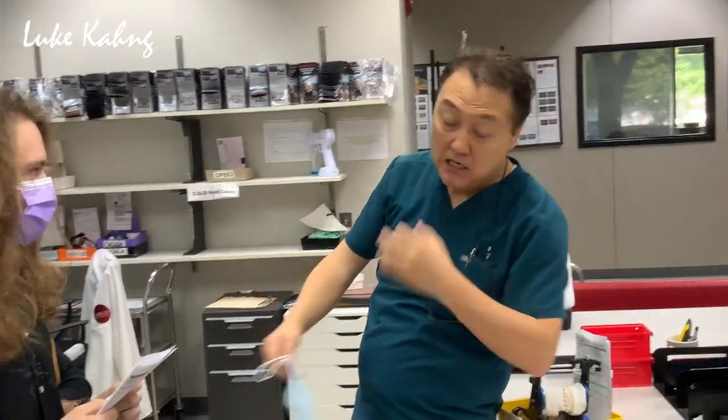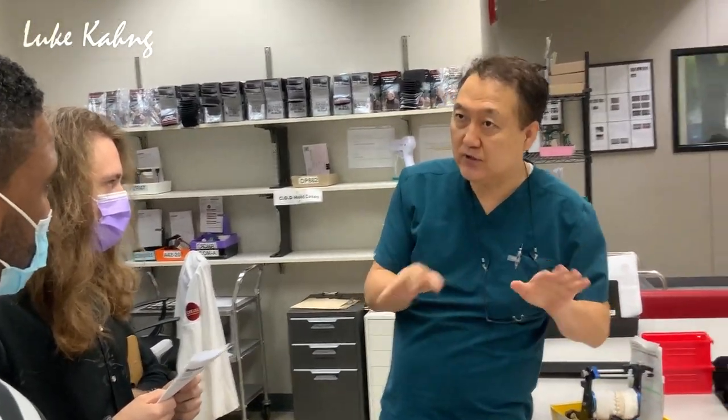So we make an immediate denture with a conversion denture. They take the teeth out and at the same time drill for the implants. In one day, same day, they put everything in the patient's mouth and check the occlusion contact. But the problem is the patient is sedated, just asleep, gone, so they cannot move the jaw. So they need a really good technician in the chair side. But the dental technician is the big issue. The dental technician is here, we are ceramic guys.